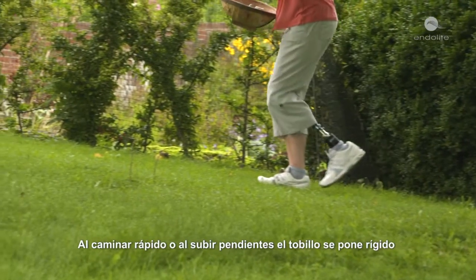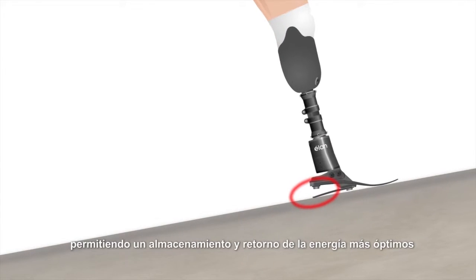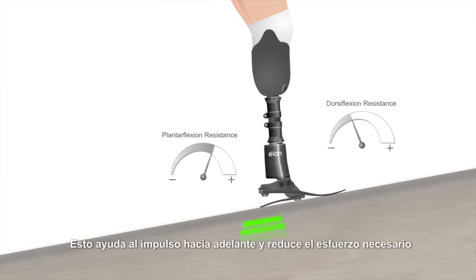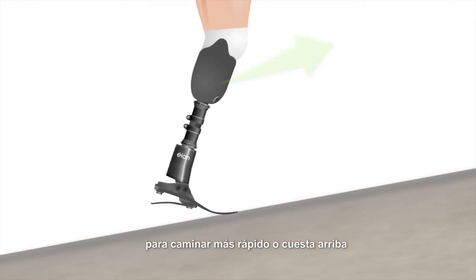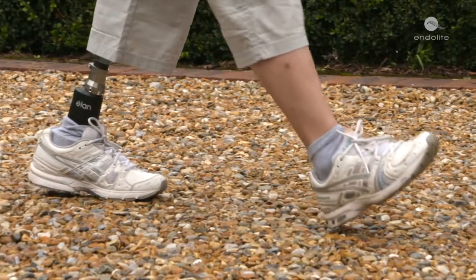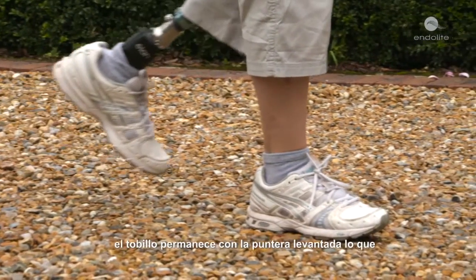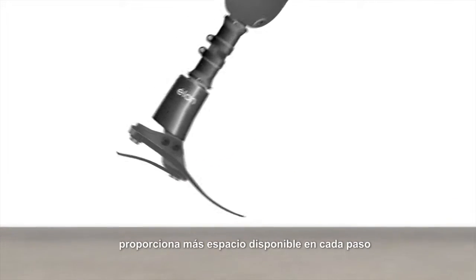When walking fast or up slopes, the heel stiffens, allowing for more optimal energy storage and return. This aids forward momentum and reduces the effort needed to walk faster or uphill. During swing phase — that's the time when the foot is not in contact with the ground — the ankle remains in a toe-up position, which gives increased toe clearance on every step.